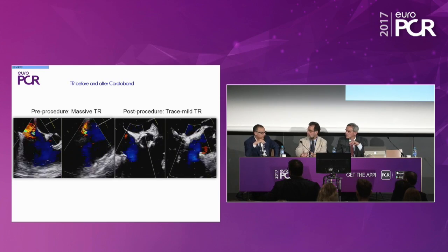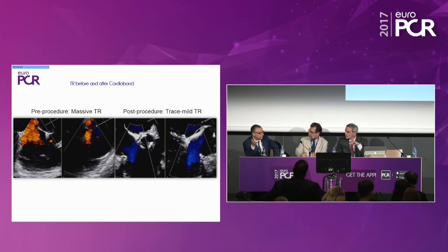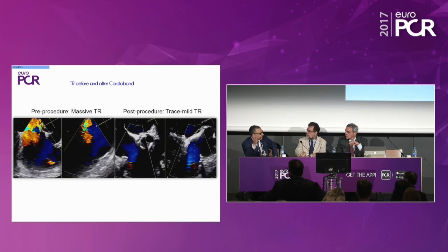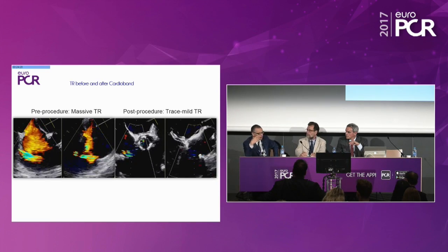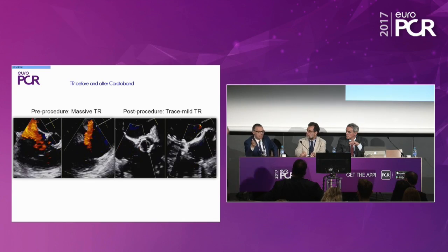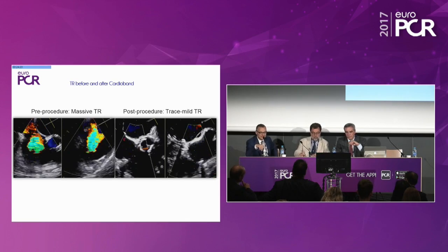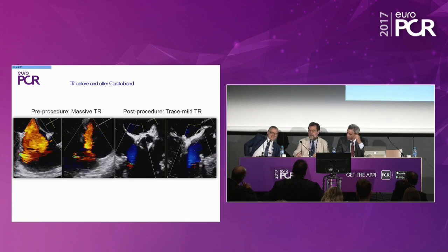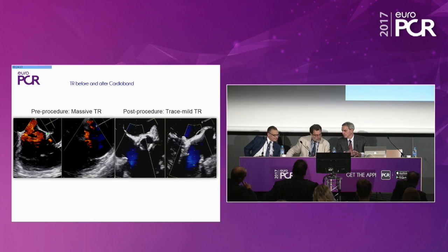Obviously, I love to treat the tricuspid. I hope I will not do it so often because I think it is a missed opportunity. Once we treat patients with isolated tricuspid, there's been a mistake in the timing of the previous interventions. Tricuspid comes last, so we should really implant Cardioband in the mitral very early, so we don't have to learn how to implant in tricuspid. And just before finishing, because while you were speaking, I think Francesco was not listening.